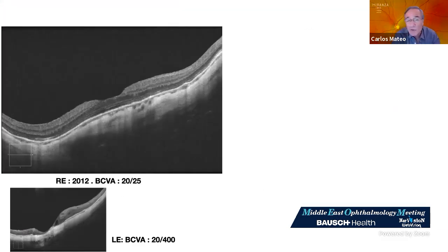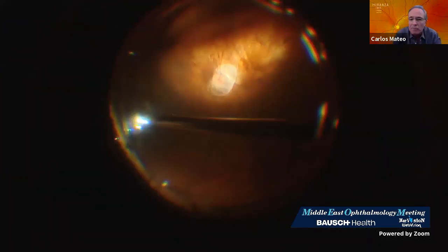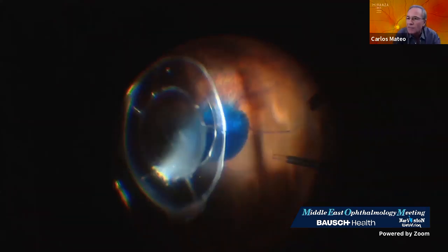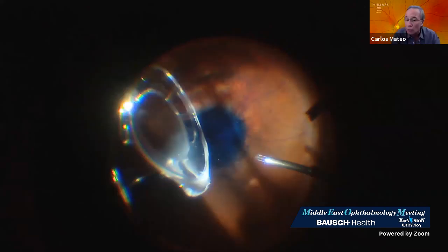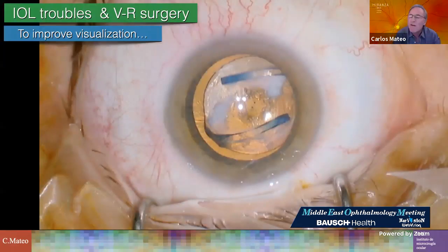But as a vitreoretinal surgeon, you have to be aware of this because imagine this patient has high myopia and suddenly she developed a macular hole with decreased vision in her only eye. And then I started my vitrectomy, as you can see here, only peripheral vitrectomy. And then I went down, I pushed and knock, knock, the lens fell down. Then you have to be used to managing this. And this is the aspect of the patient after doing this. And in other patients, perhaps you have this aspect, and in this aspect, perhaps you have a PVR.